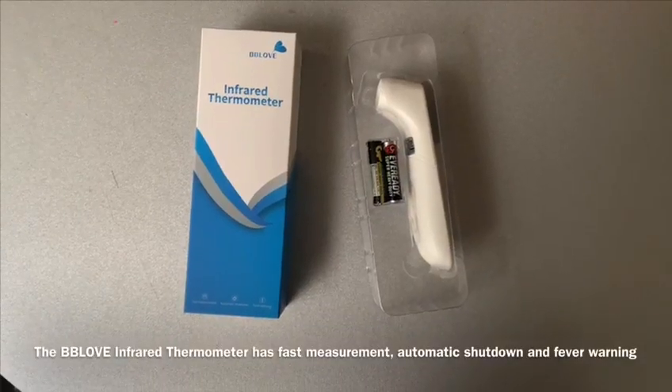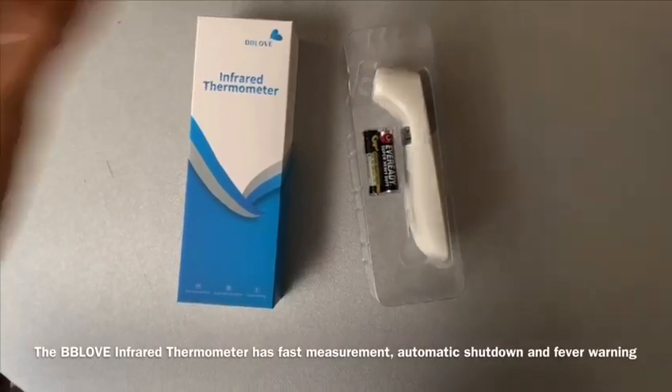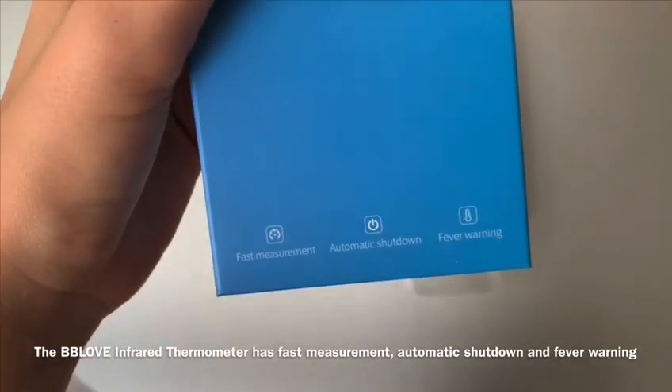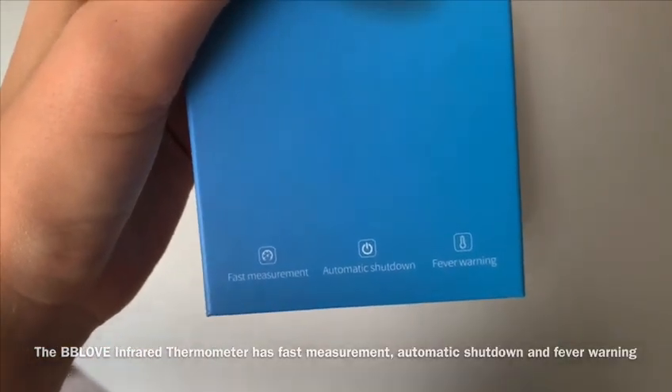This is the BB Love infrared thermometer. It has fast measurement, automatic shutdown, as well as fever warning.